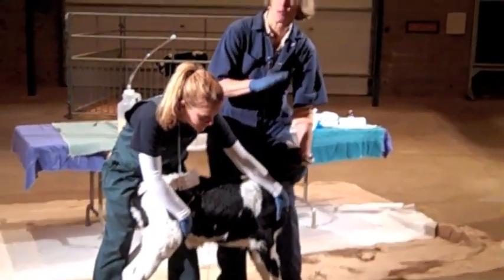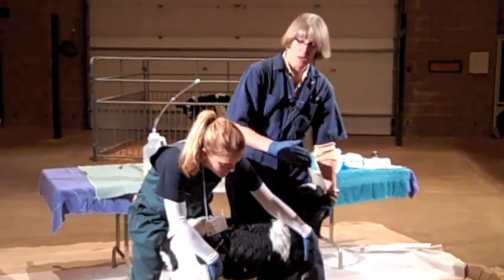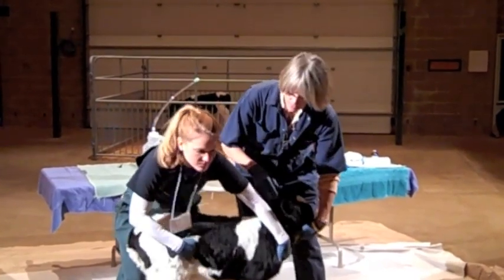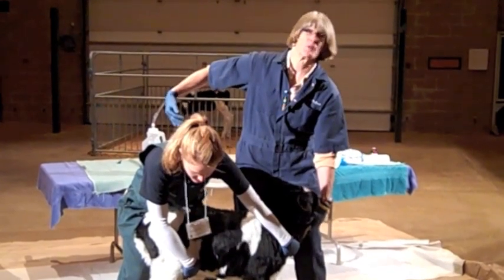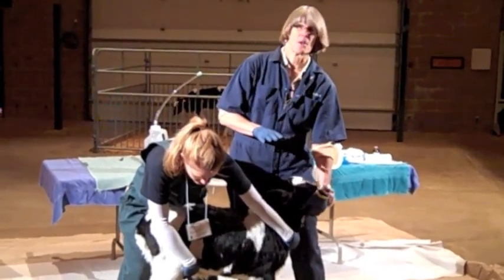The calf must be able to either sit up or stand. If I can't get it to sit up, I won't use the esophageal feeder. If it's a calf with diarrhea or a sick calf and its abdomen is big, I won't use an esophageal feeder. If it's breathing really hard, no esophageal feeder.